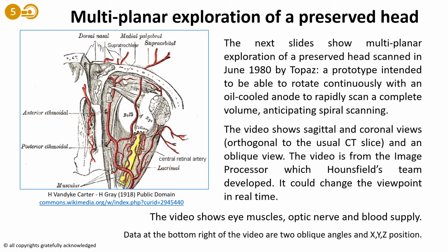Now we're going to look at some multiplanar images. What this means is that instead of just having one CT slice, you've got a whole series of CT slices stacked one on top of another to cover a complete volume. And you're going to explore them in 3 dimensions.